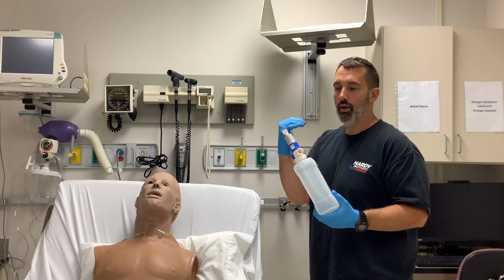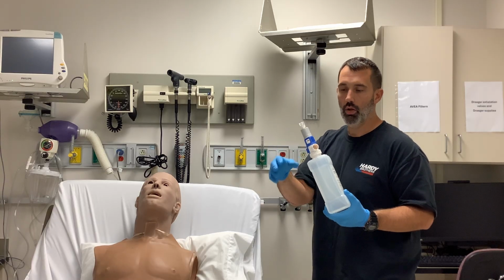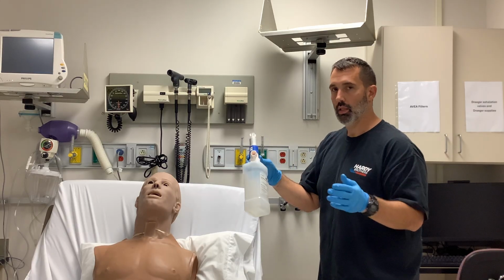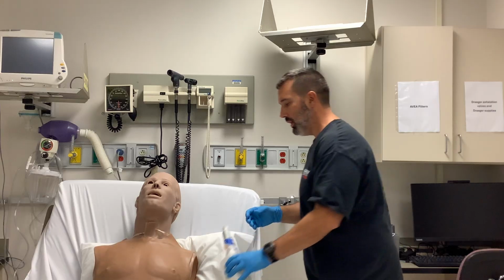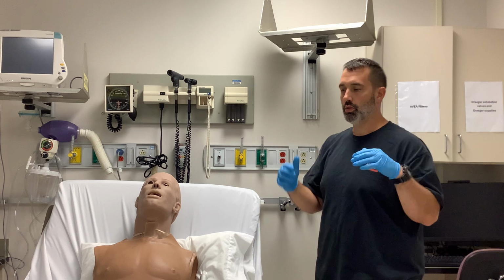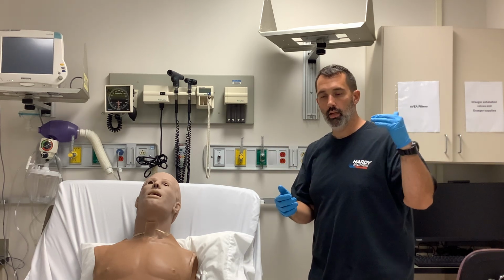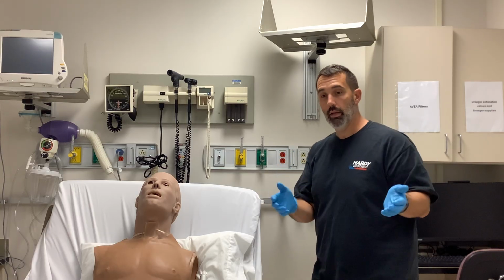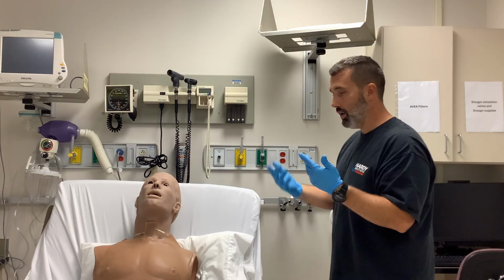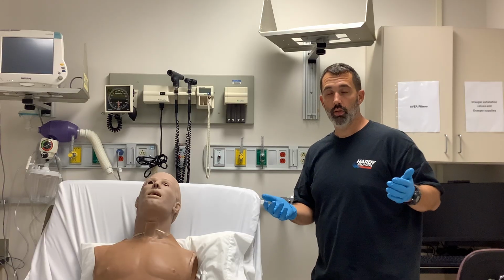An understanding at that point of your air to oxygen entrainment ratios and total output flow is going to be crucial for the way that these things work. So you've got to understand that. Depending upon what textbooks you utilize, you can go through and do the magic box. There are other ways of figuring it out, but there are some common ones that you need to know, like 50%, 30%, 40%, 35%, 28%, and so on, 100%, 0%. Just mathematically, because I'm not going to write stuff out or use a calculator, I'll utilize some relatively easy ones for us to understand.